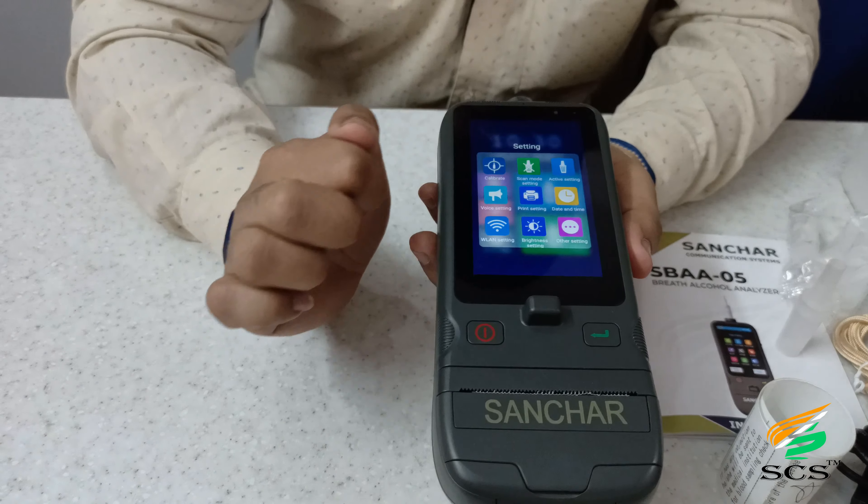The About section allows you to access device information such as Android version, CPU, RAM, Bluetooth, records, and memory. The lanyard helps carry the device easily. The charging adapter and C-type cable are included. When the charger is connected to the device, a red color light indicator shows on the device.